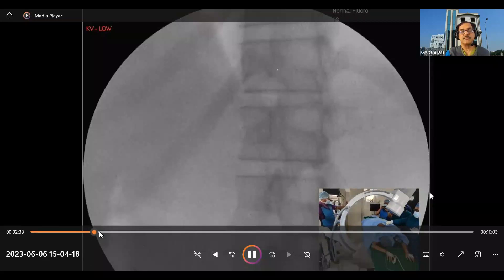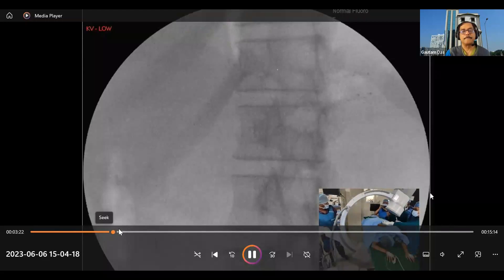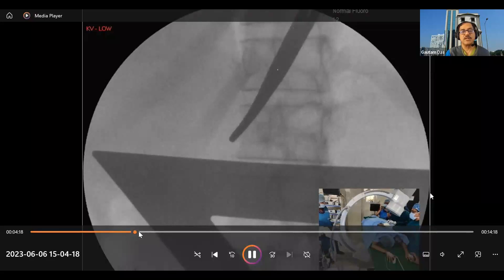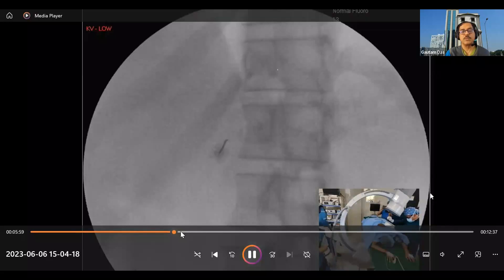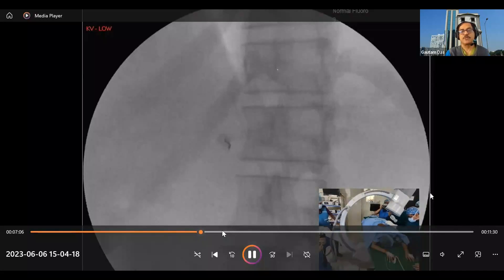We place a scale and draw a line along the lower border of L1. This forms the triangle, and the middle of this triangle is our needle entry point. We then proceed by tunnel vision — advancing the needle with perfect tunnel vision alignment.